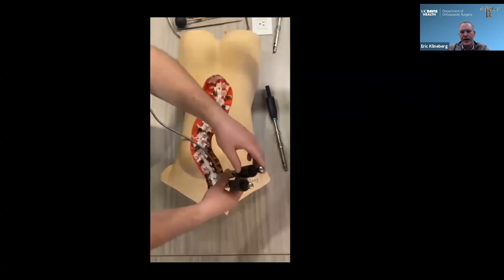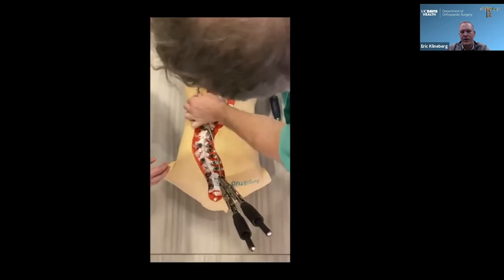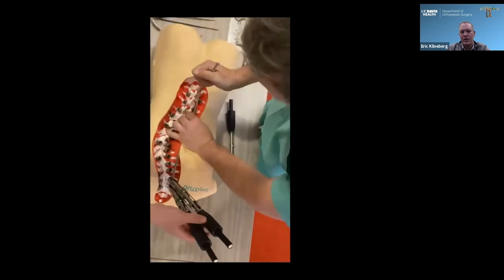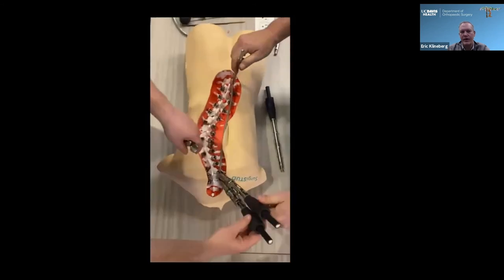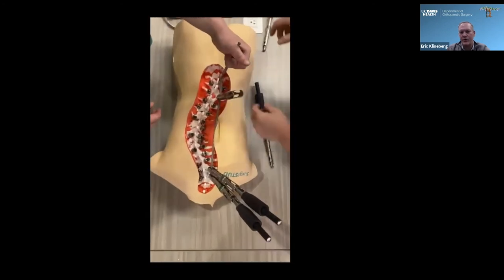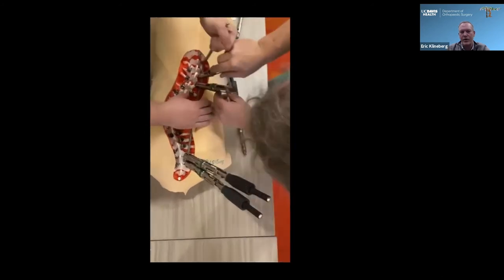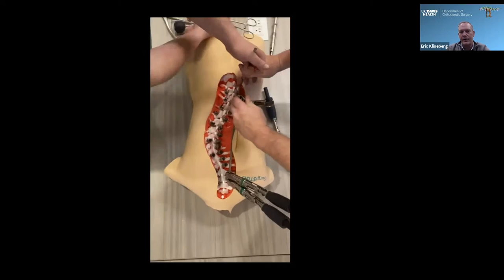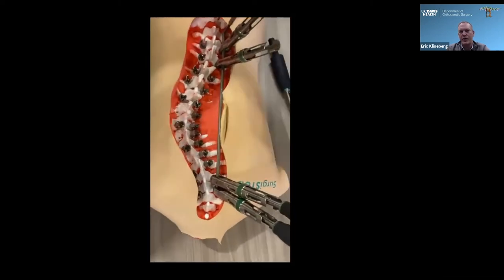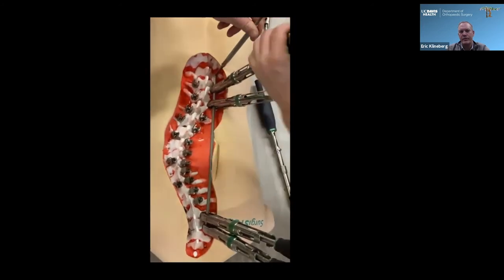You can see it's not even in the skin. It's sitting way off to the side. Get it locked over. And then bring it all the way off to the side. And you can see it's not even in the skin anymore in that middle segment. Most of the time when we're first starting, you look at that rod and you look where the spine is and you go, there is no way we're going to be able to hook that all together. And just through slow, gentle translation, we'll slowly bring that rod back over in place.